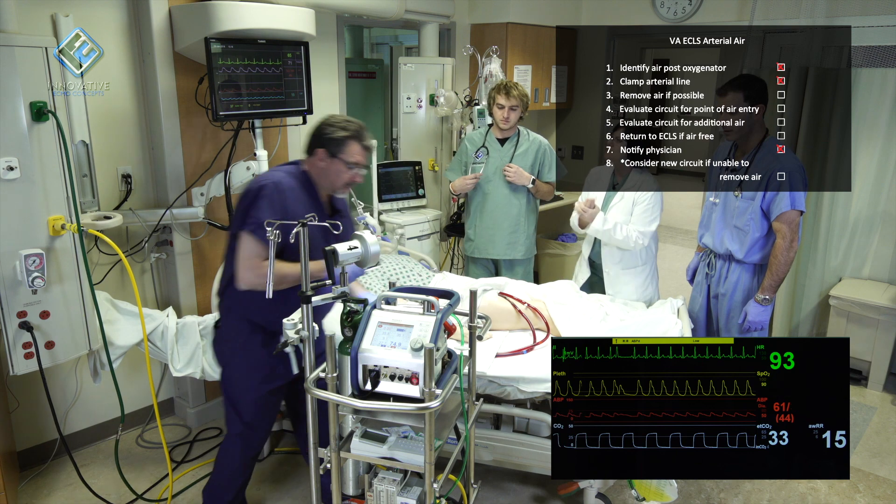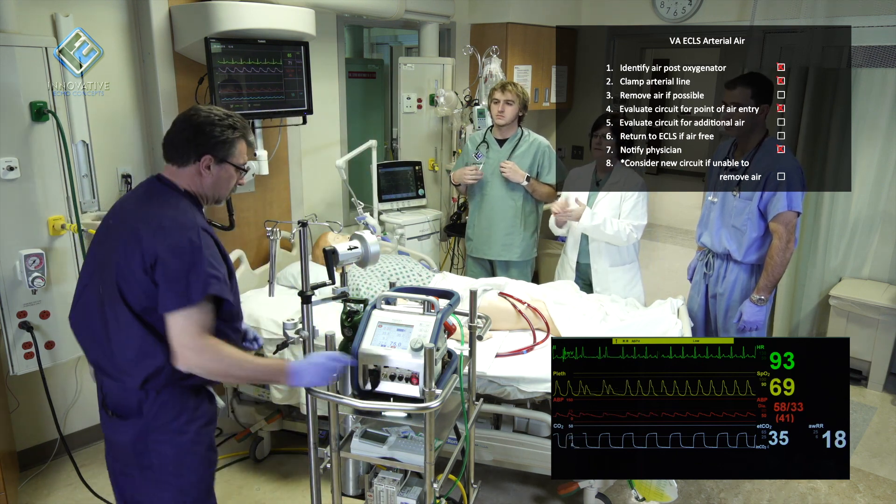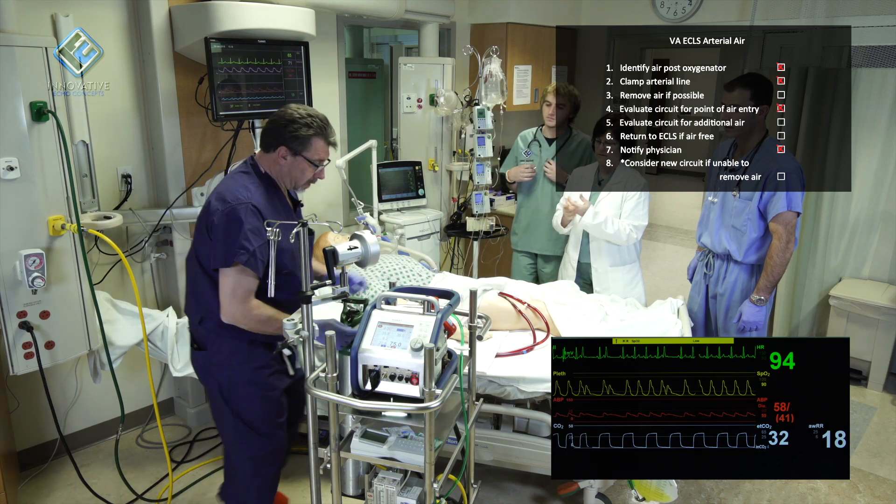Is there a problem in here? Yes, ma'am. When I was flushing the arterial line after I drew my sample, I infused a bubble. I'm going to try and draw it out.